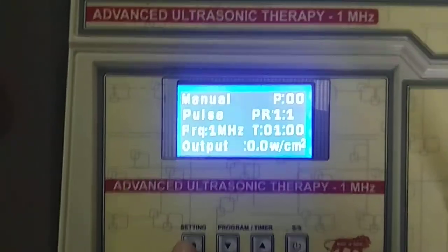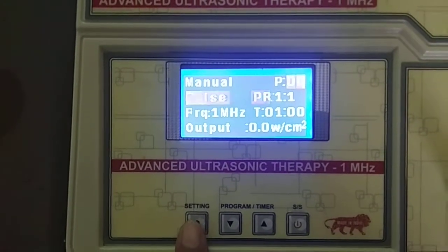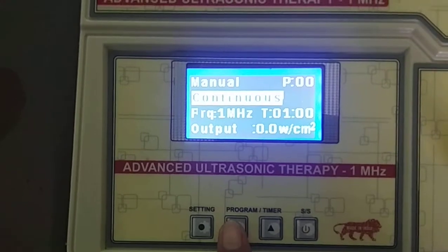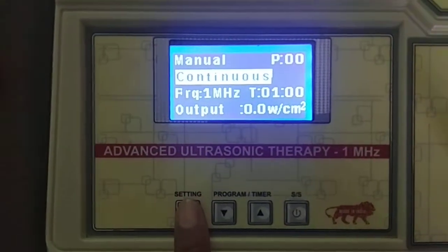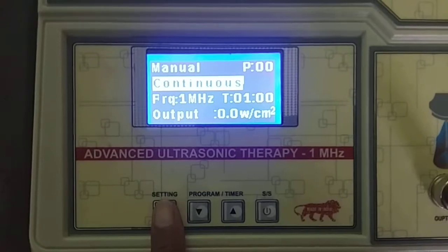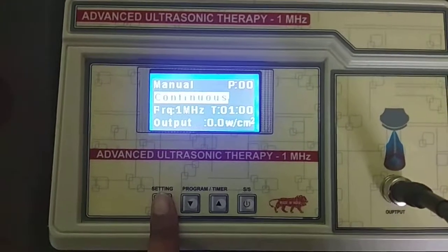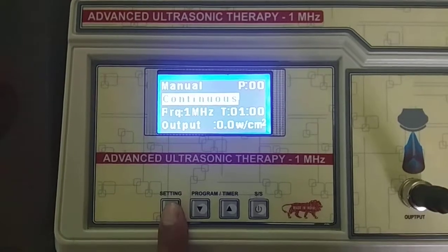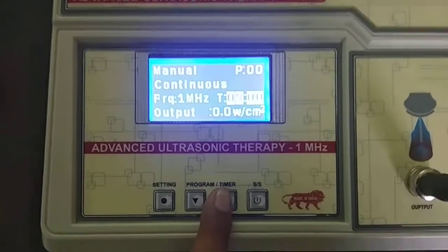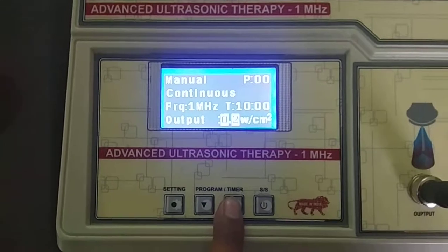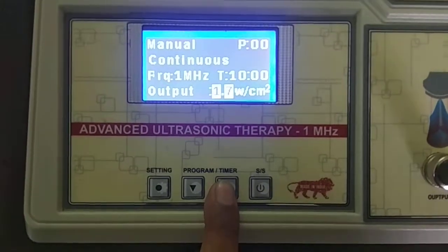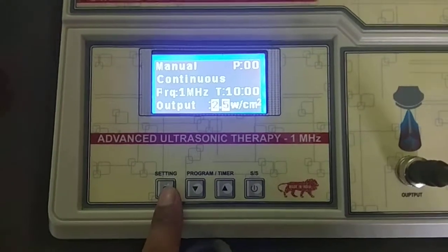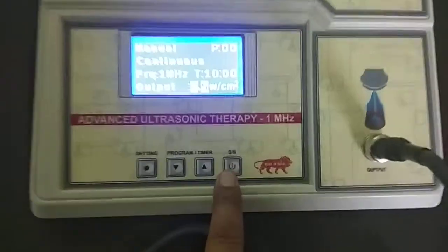Coming back to Manual mode — I have shown you Pulse mode. Now I am going to show you Continuous mode. In Continuous mode, the pulse will generate continuously. I am choosing treatment time 10 minutes and output 2.5 Watt per centimeter square. Finally, I press the Start and Stop key.